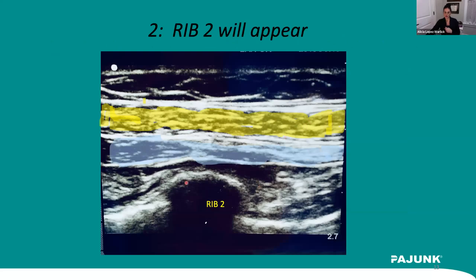And the image that I'm going to get is this image of rib 2, which is directly under the axillary artery, that I will achieve by tilting the probe over. This is the pec major muscle and the pec minor. I still see those pretty good. And this is actually the image from that woman in the picture. She's pretty lean, and so I don't see a lot of adipose here.